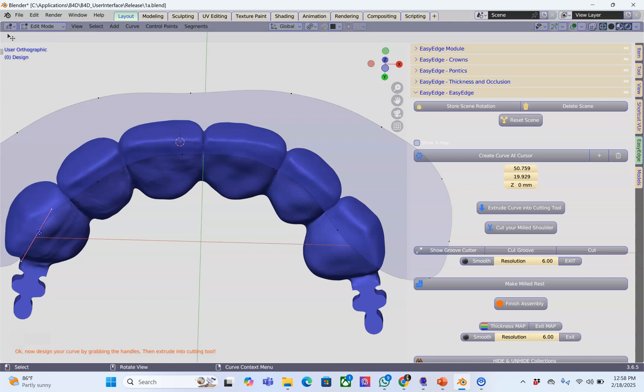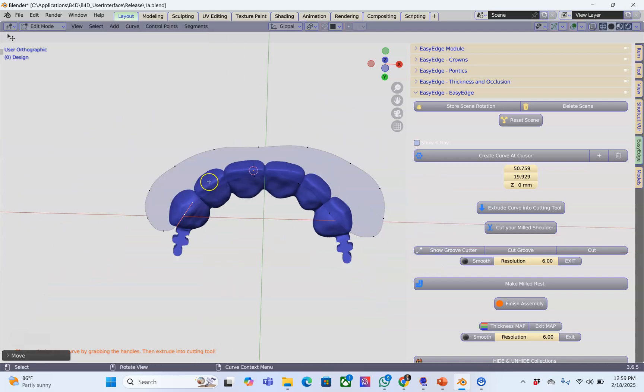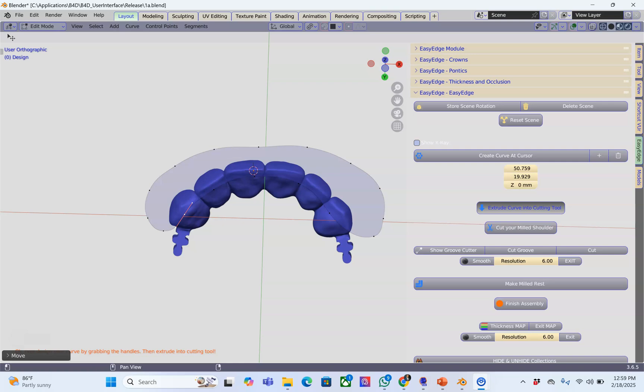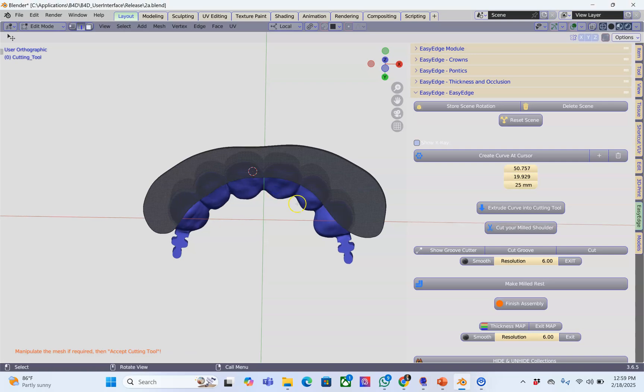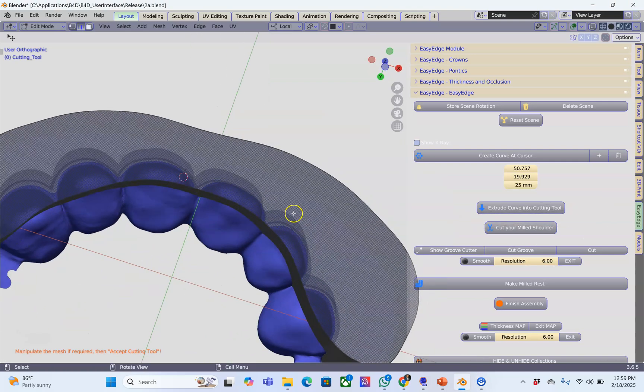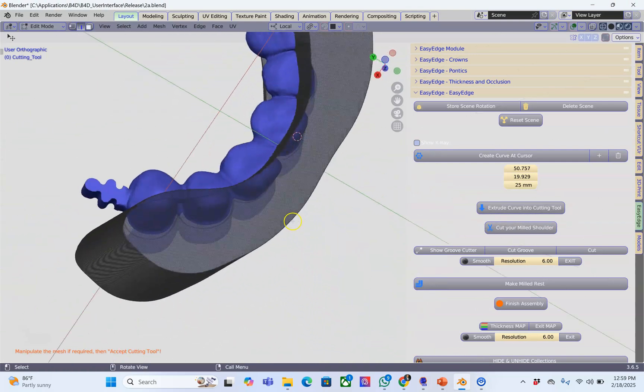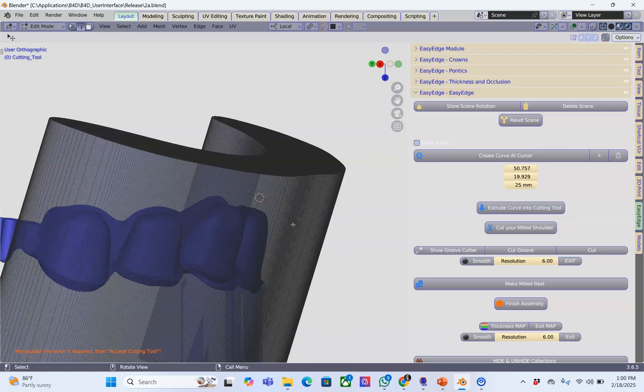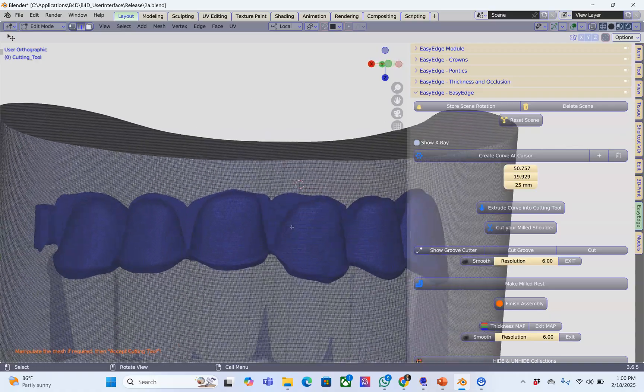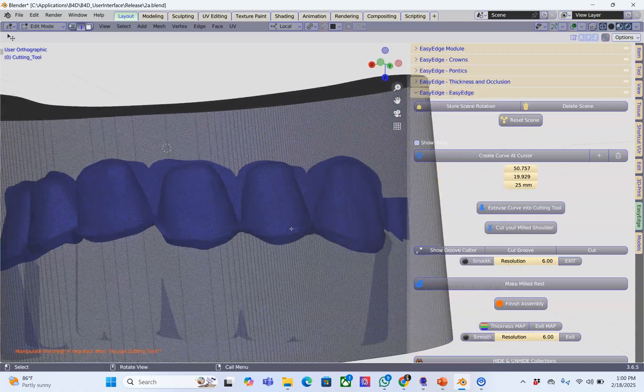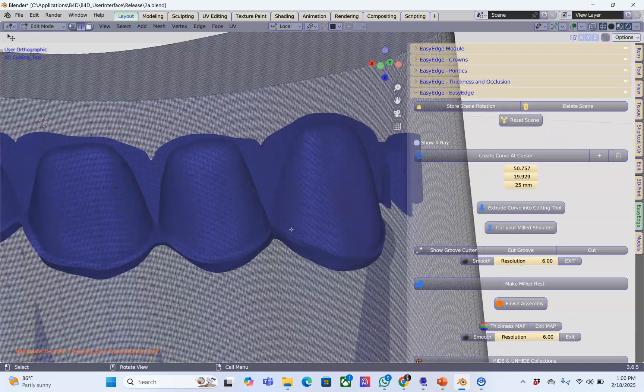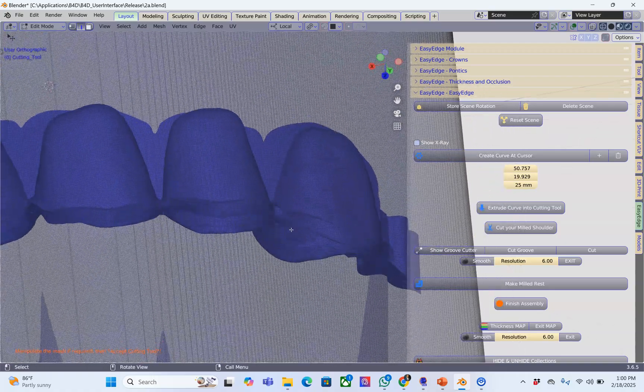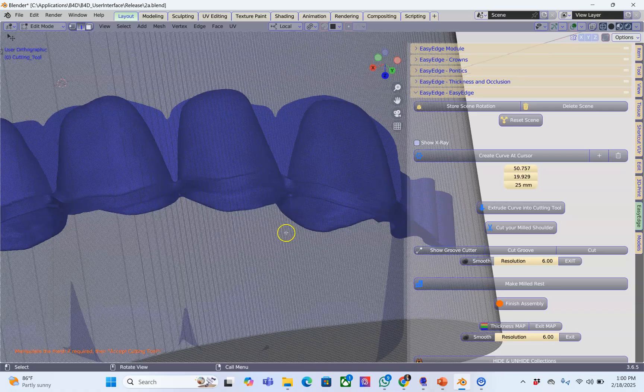From here we're going to cut off the labial surface. Let's see how that looks. Extrude cut curve into cutting. Here we can see we've got a cutting tool. How easy was that? It's all parallel. That was very quick to do. We've got a bit of a margin over here.